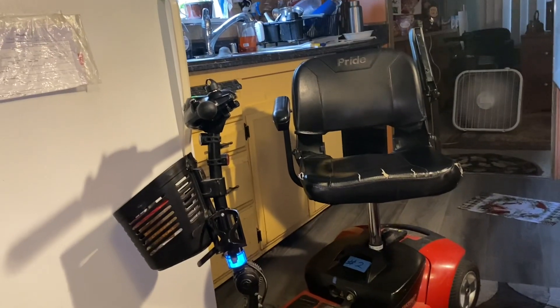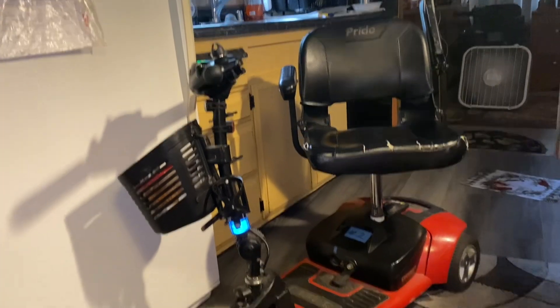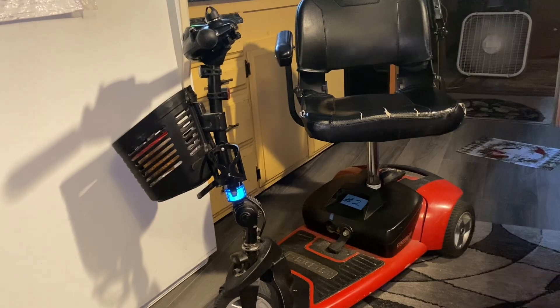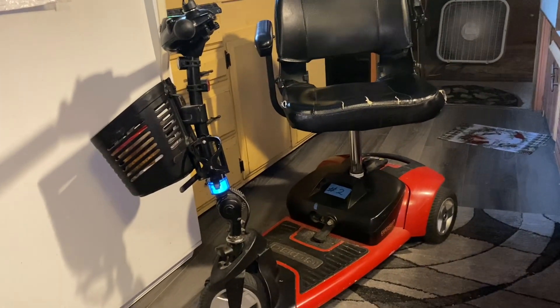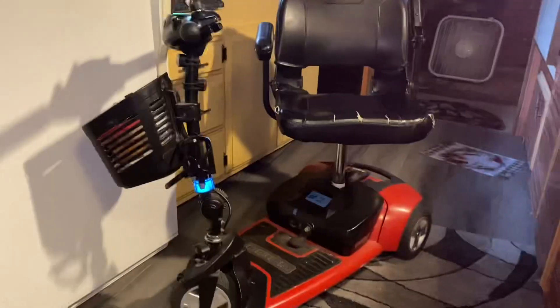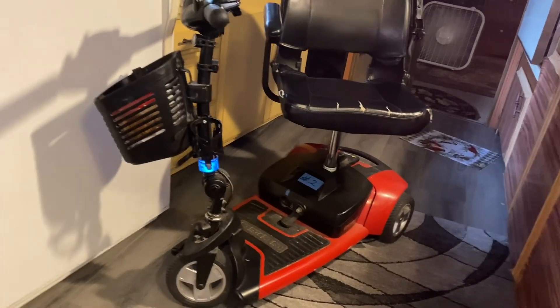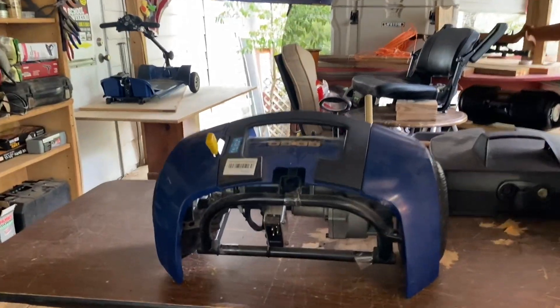People are wondering how I fix this because it's a very common problem in these scooters. Right now I have four of them — two red three-wheelers and two blue four-wheelers. This one works currently and is my daily driver.